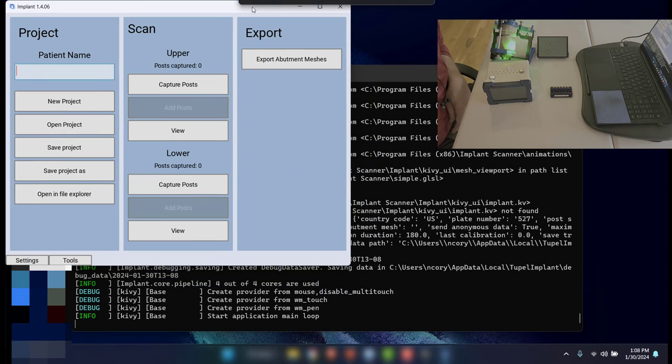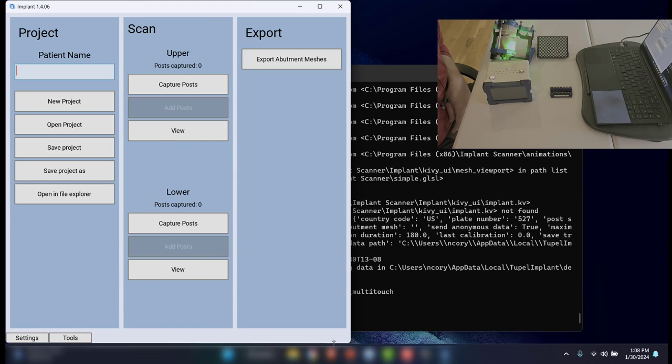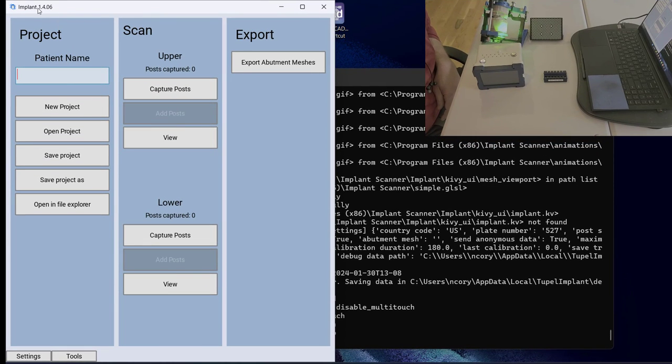And what I'm going to do is just put this over here on one side of my screen so that I can do a split screen. All right, so here's the implant scanner software.